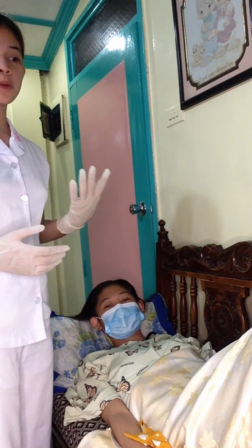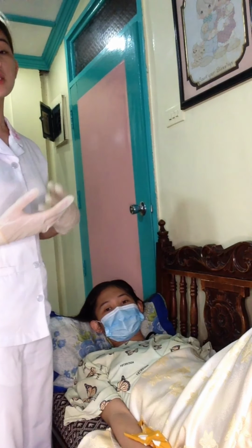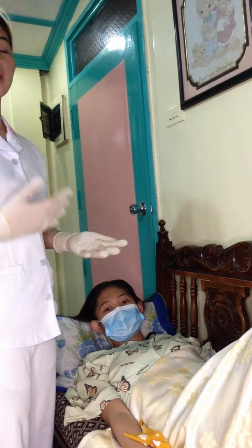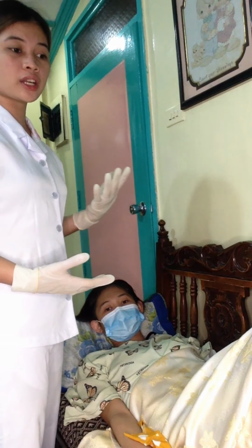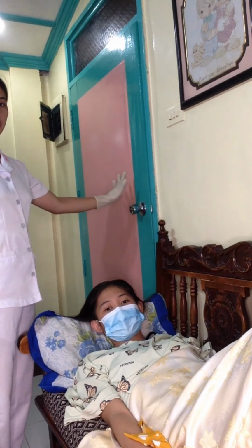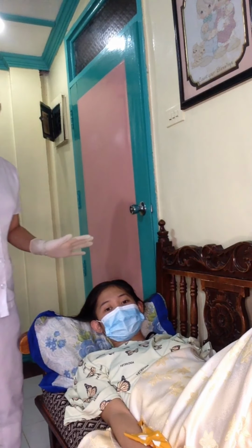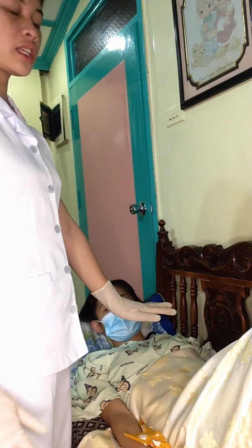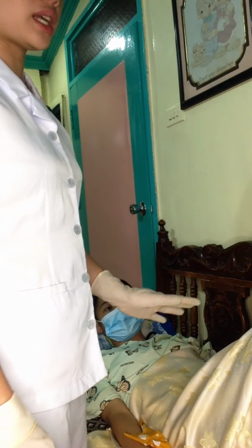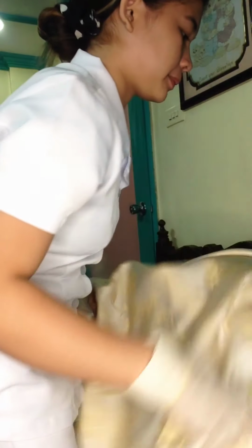So, next is provide privacy by screening or closing the room and position the patient in dorsal recumbent with the knees flexed. This is to protect the patient's dignity, and the key to a good urinary catheter is getting them in a good position. So, I already closed the door to protect our patient's dignity. So, next is drape the patient, exposing only the area to be used. This is to reduce the risk of infection. Ma'am, I will just bend your knees, ma'am, okay?